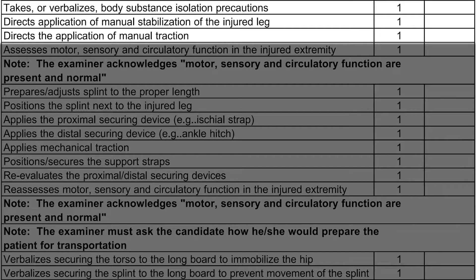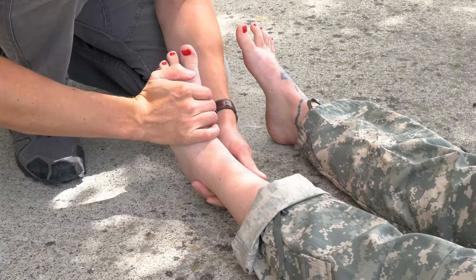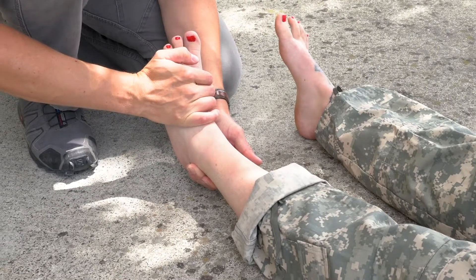Just like any other splinting intervention, after taking the appropriate BSI precautions and determining your scene is safe, you'll apply manual stabilization to the injured part, and in the case of traction, we'll apply manual traction to the injured part. When applying manual traction, I like to cup one heel with my left hand and hold the top of the foot with my other in order to allow enough room for a helper to place the ankle hitch. When preparing to apply manual traction, communicate with your patient that the step you're about to perform will likely be very painful for them but will soon help to alleviate their pain once completed.